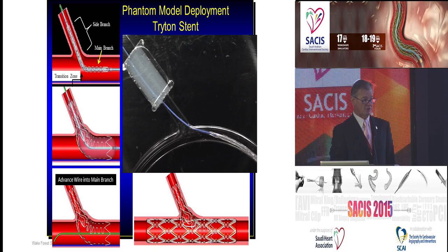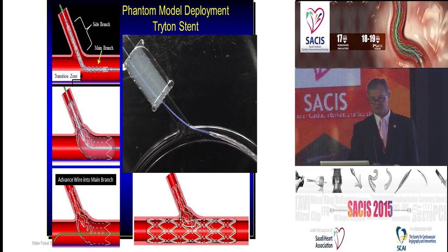And the concept here is that we want to start with the diagonal or the branch vessel first, securing access into that vessel, and then allowing us from there to use this as a platform which, as I had said earlier, can simply be used depending on what kind of further anatomy that you have. They're going to take this out in just a second and show you in this model what a final version might look like.